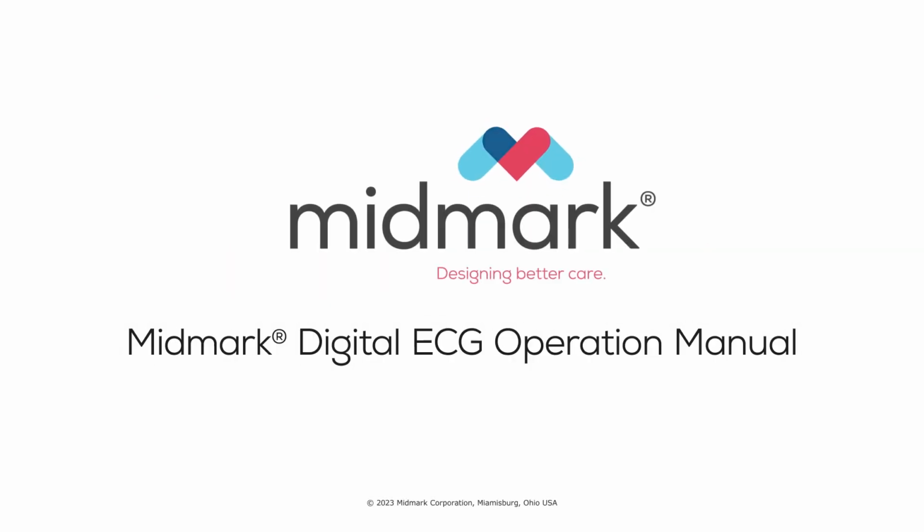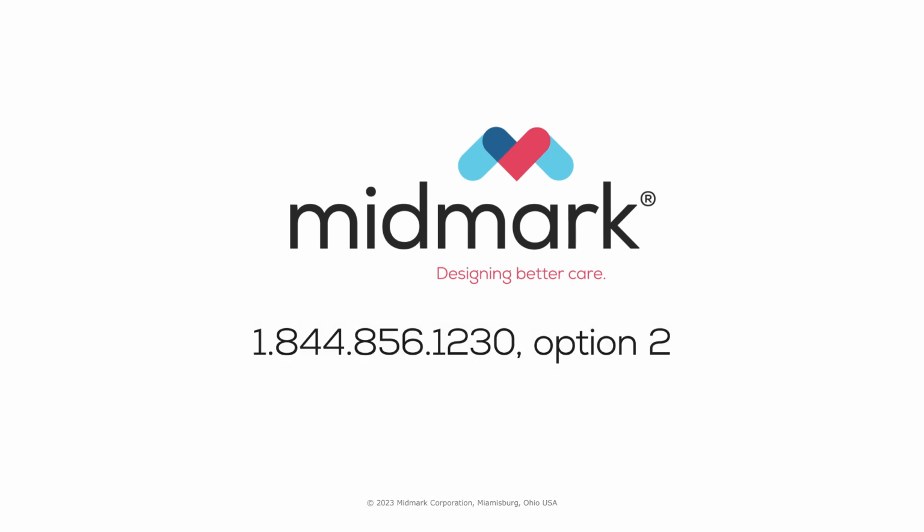For more detailed information about reviewing a report, please refer to the Midmark Digital ECG Operation Manual. For further support, contact Midmark Technical Service at 1-844-856-1230, option 2.